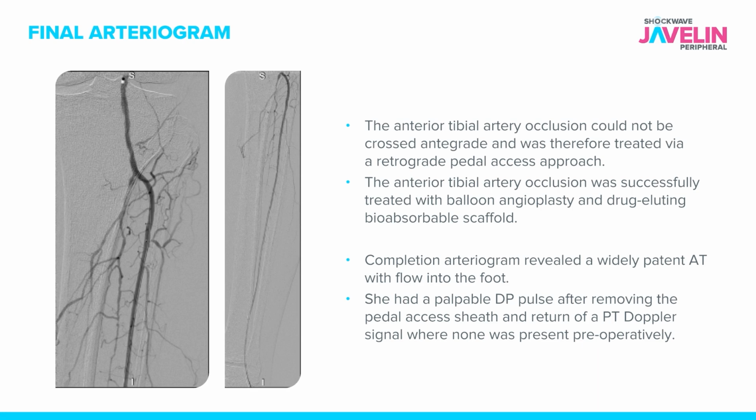So at the completion of the case following removal of the retrograde pedal access sheaths, she had a palpable dorsalis pedis pulse and a posterior tibial artery signal from that retrograde plantar flow where there was none present preoperatively. So she had a very good radiographic result from this procedure. And Javelin catheter allowed us to really facilitate successful definitive therapy on that SFA pop occluded segment.